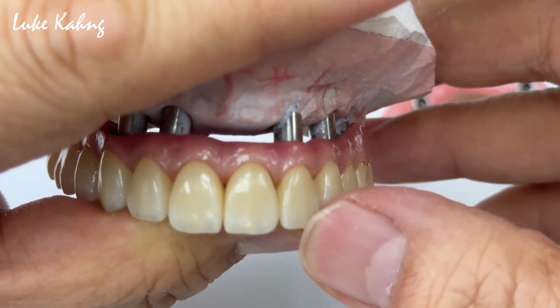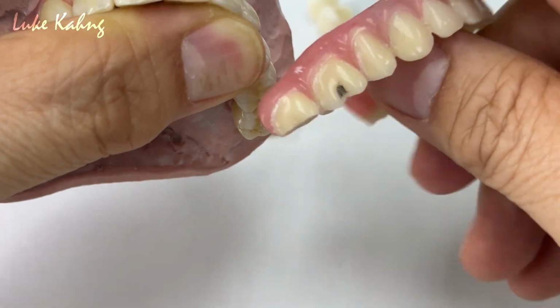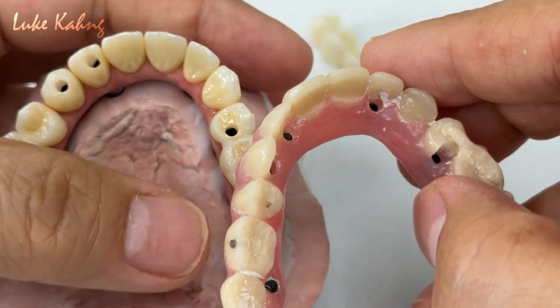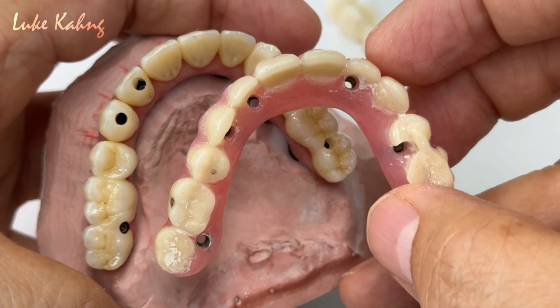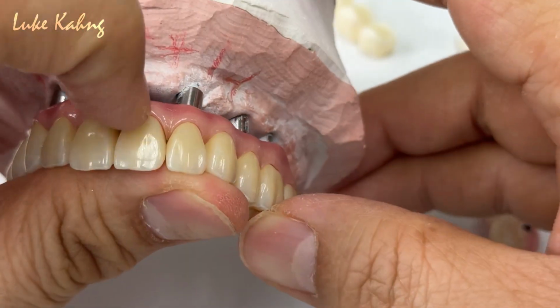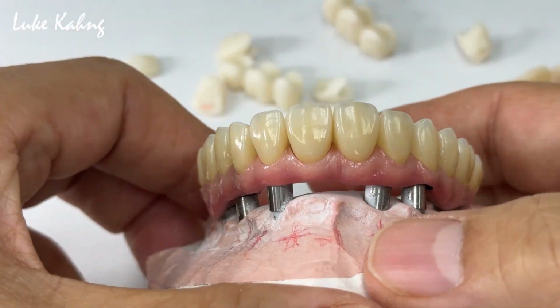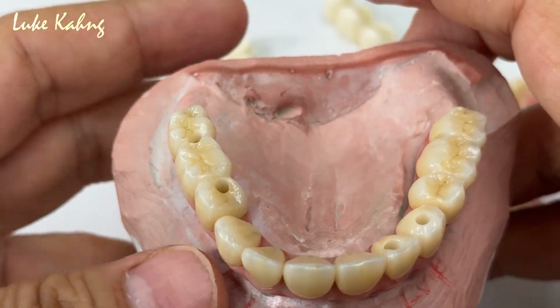See the great amount of translucency, and we decreased the PMMA from here to make lifelike restorations. Okay, it's thinner. Okay, thinner than this. And this is going to be the finals. Now to show you guys about before we put the cement underneath, so you will make the one piece.